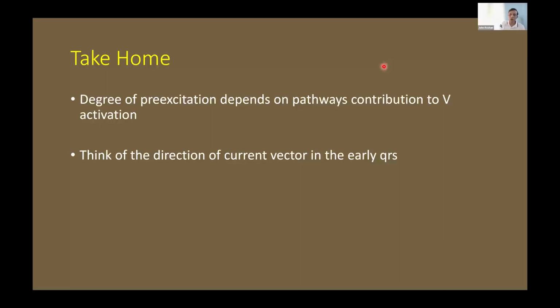Yeah, so the short PR interval is something that you have to be very alert about, because in the pediatric population, the AV node is very slick and you can have PRs which are pretty short. So if you see a short PR interval in a 40-year-old, the implications are different from seeing that in an 18-year-old or even younger age group. So I would be a little cautious in labeling short PR intervals as obviously having accessory pathways. And when in doubt, you could always give an adenosine injection to check or put the patient on a treadmill and see what actually happens.